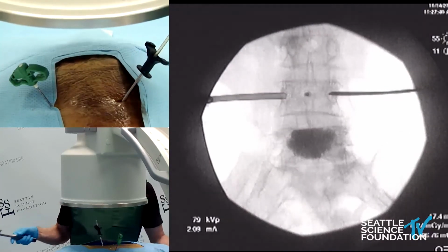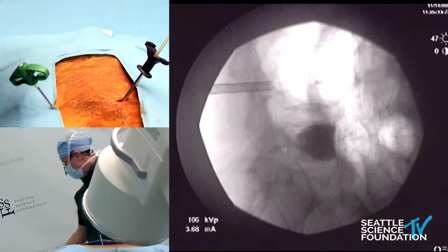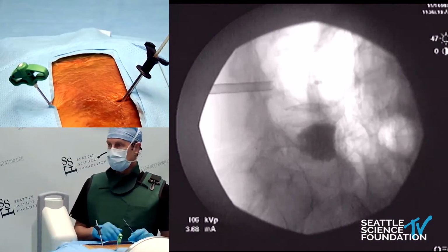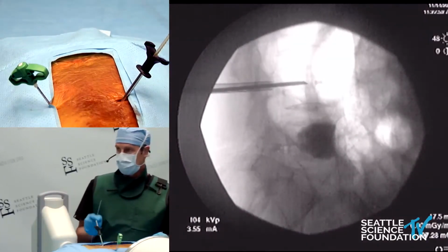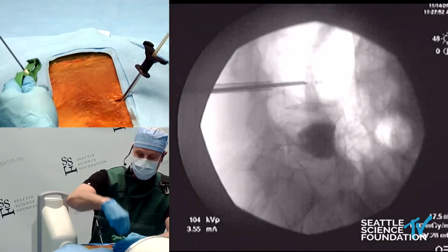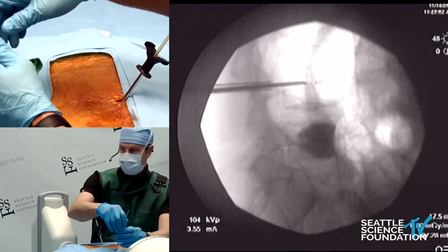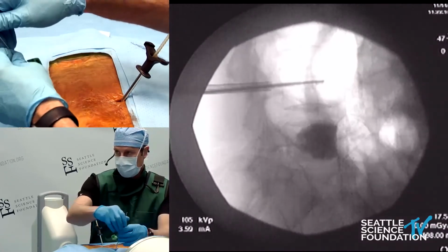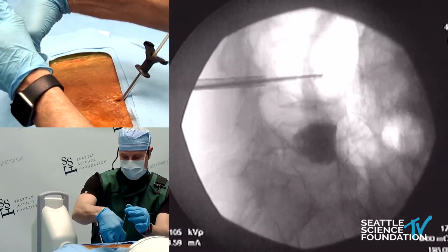All right, so that's very flat, very nice. Let's take a look lateral. And again, we'll swap out the stylet with the K-wire. Yep, that's good. So this is nice. So we're a little bit ipsilateral to this side. So I want to put the K-wire in. I want to demonstrate the fact that you can change the trajectory with the reamer. So I'm going to put the K-wire all the way out to what would be the final resting position. And let's take an AP shot of that.